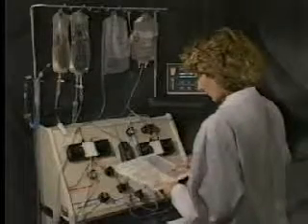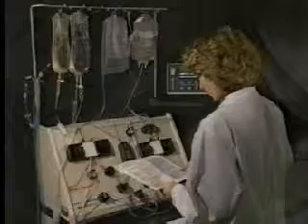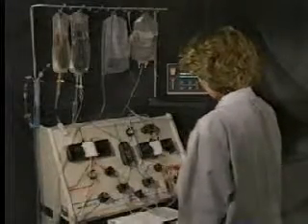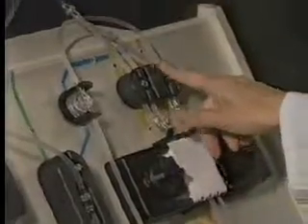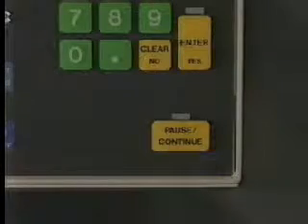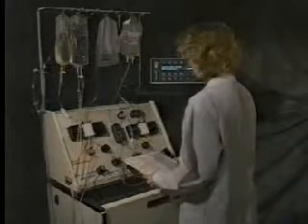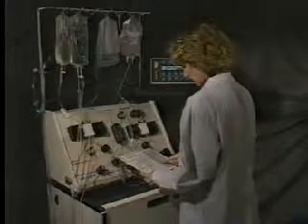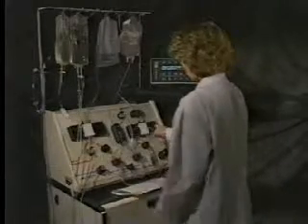Welcome back. You were troubleshooting the alarm that read return pressure sensor did not reach alarm limit. Let's review some of the possible causes for this alarm. One possible cause is misloaded tubing. Once you have corrected the problem, press continue to clear the alarm. This alarm also occurs if the return pressure sensor is not placed properly in the sensor housing.